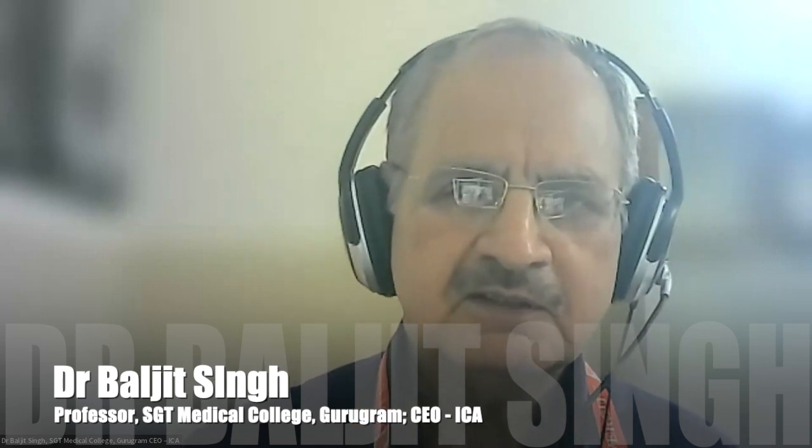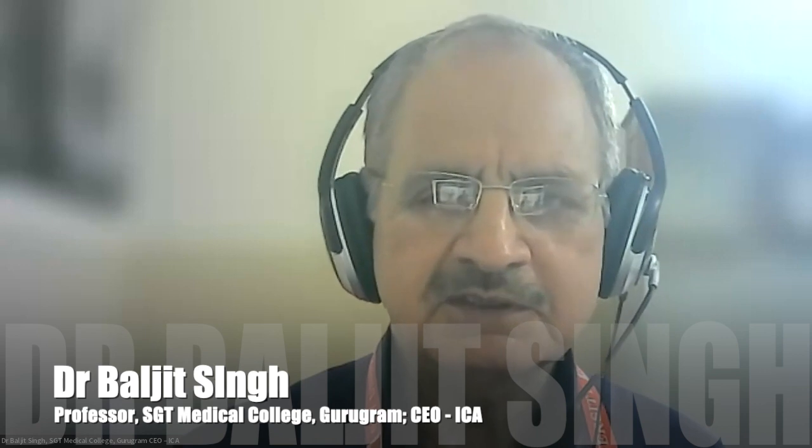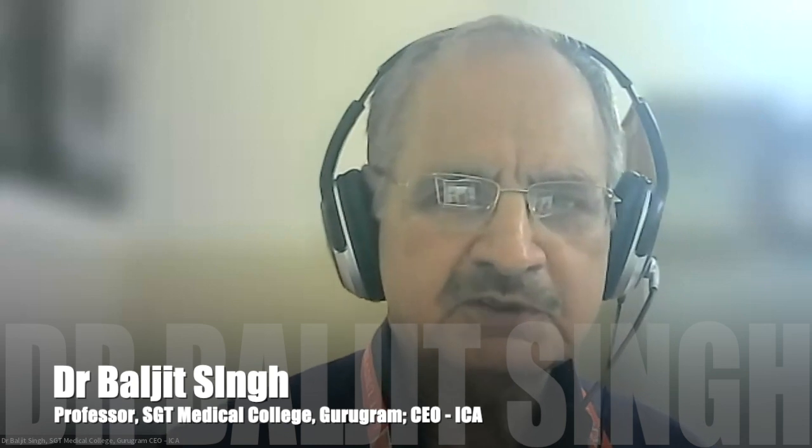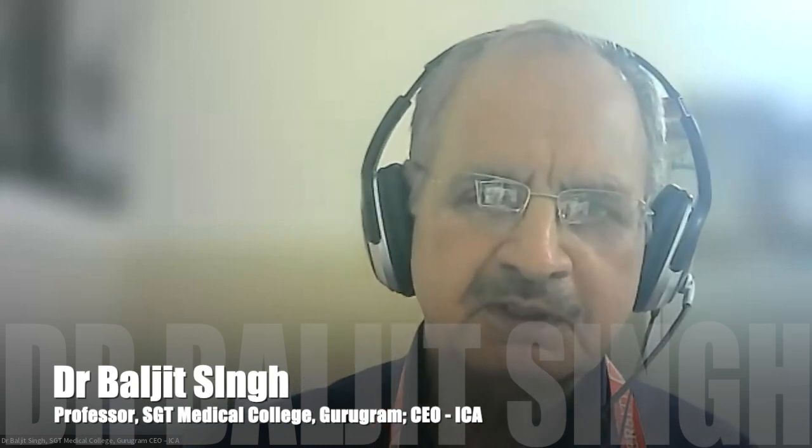Now we have very modern anesthesia machines. I think all these machines have been demonstrated very well by all the colleagues. There is a power backup on all these machines. It varies from company to company, but generally it is about 45 to 90 minutes. Most machines have around 60 minutes or so, so the machine can carry on with that. There is no risk of total darkness, because the rotameters have a very soft light, so we can see them very clearly even if there is total darkness in the operating room.